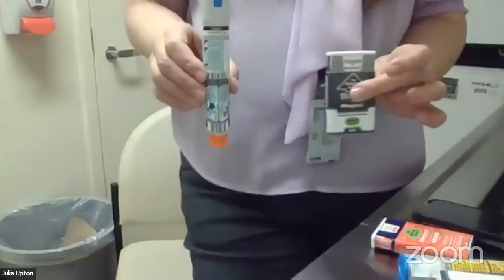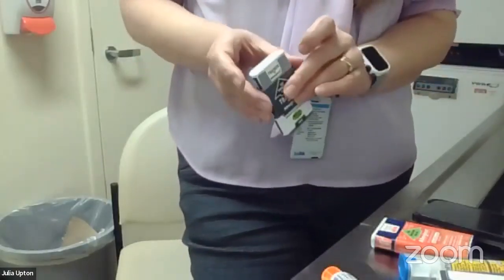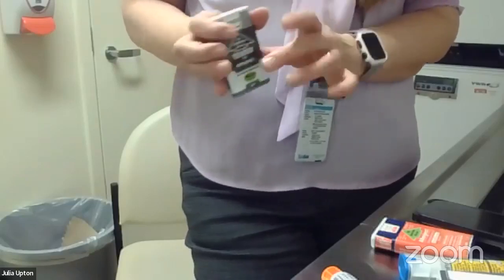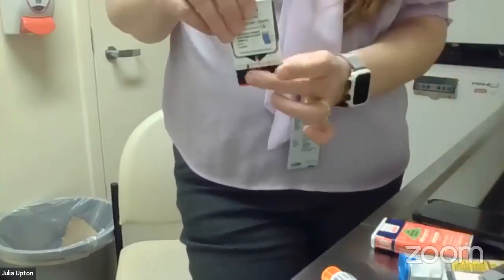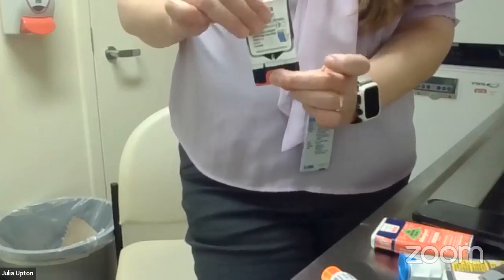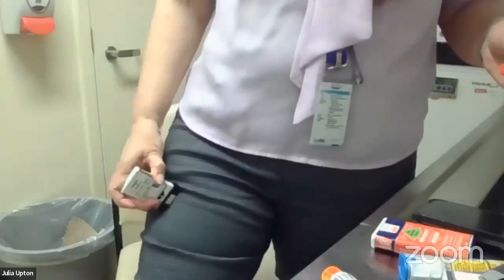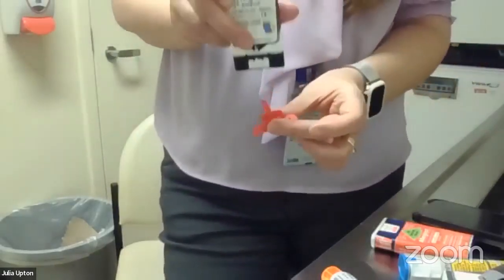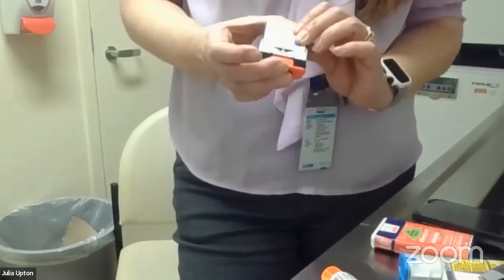And then this one, of course, people are often very familiar with it. You probably did see I touched the back of this one a little bit. Maybe I was trying not to, but just its form factor, I do find that I end up touching the back a little bit. It's a little bit different because this one, the lid is where the needle is, right? I just really want to highlight that the Allerject, you take the red bit. Outer thigh. 5, 4, 3, 2, 1. Injection complete. There's no real way to make it stop talking. This trainer is for training purposes.